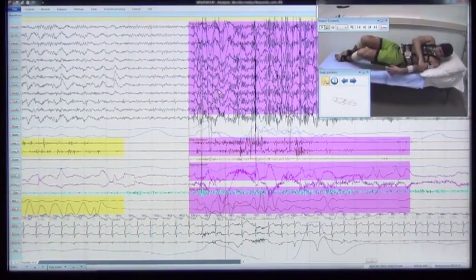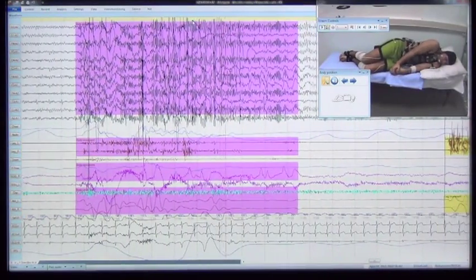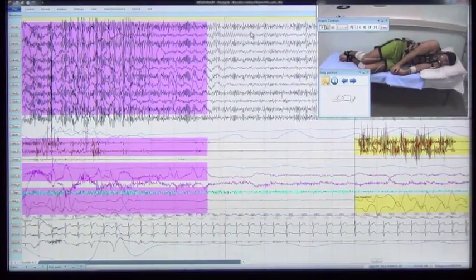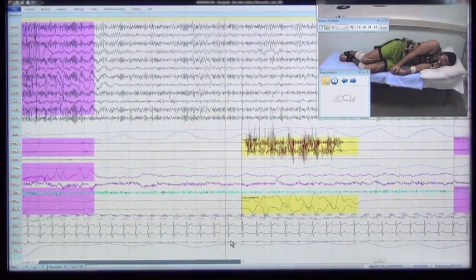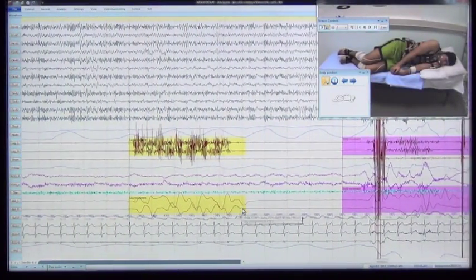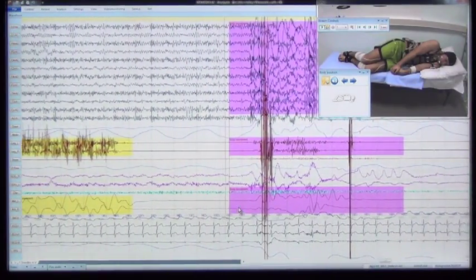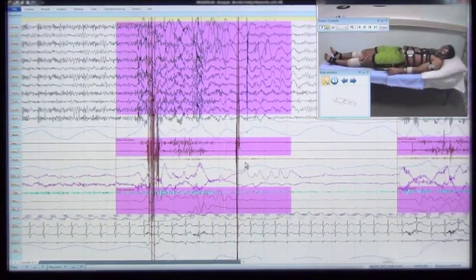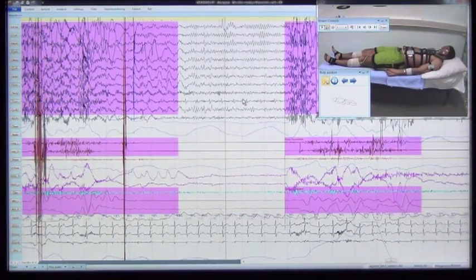The patient turns onto the right side, causing a general body movement with responses in all channels. All recorded signals quickly restore their quality after the movement. A limb movement is shown, followed by further body movement as the patient turns supine. All recorded signals restore their quality.